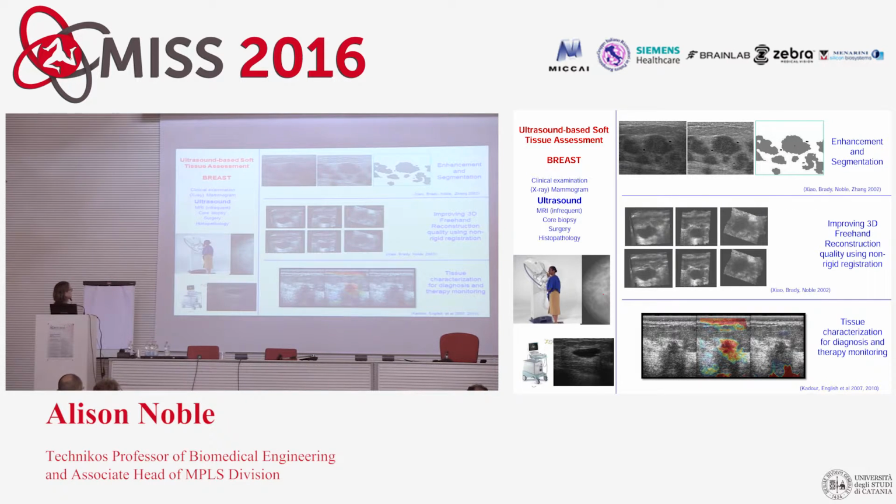Another example, as I said, where ultrasound is used very widely is in breast cancer and oncology screening of other conditions as well, but particularly ultrasound. In the clinical pathway of a patient who goes through a breast care clinic, it starts with identifying a suspicious mass by clinical examination, or you pick it up by X-ray mammogram.